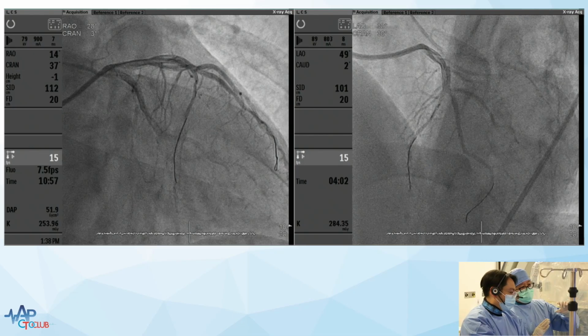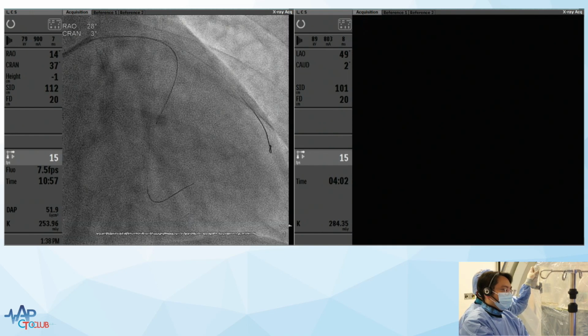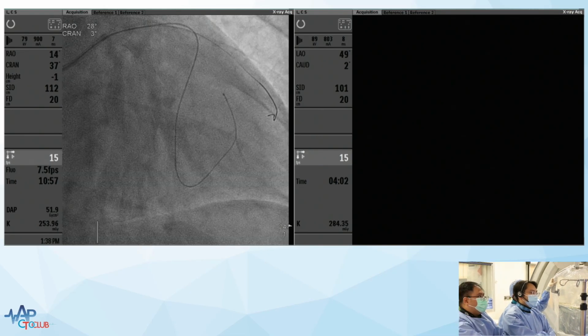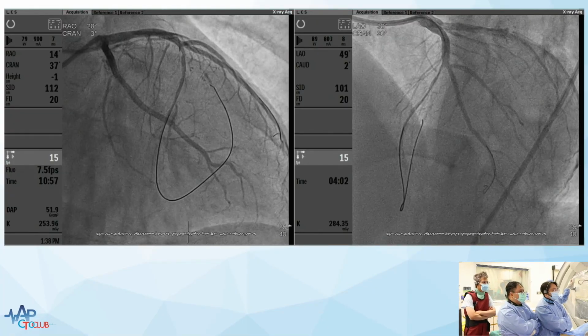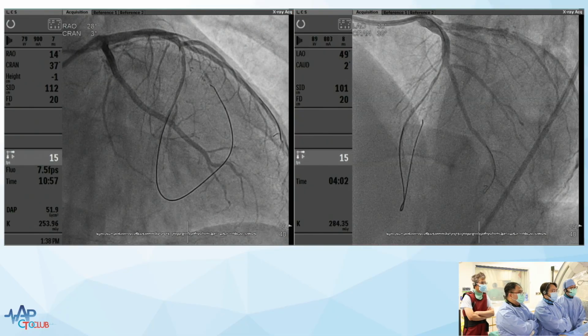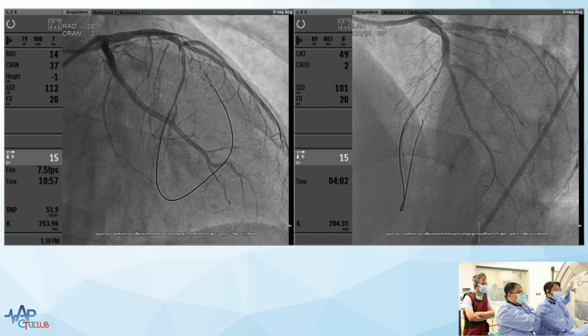So we have some information before we can go into the true lumen. Yeah. So what we did is that we went back to the retrograde tip injection. I think the other point is that doing real-time wiring of the cap there would be very difficult because of the small caliber of the vessel, right? So when you had the IVUS there, you mean it occupied the space? Yeah. It occupies the space, so it becomes very difficult when there's disease and the lumen's not big enough.